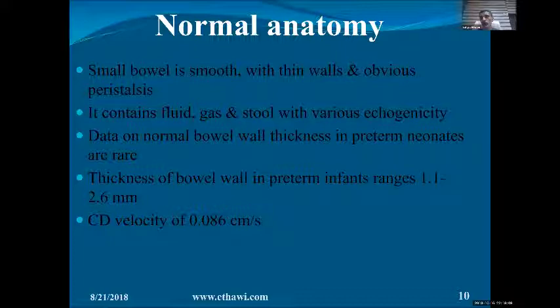So you measure all the time of the beams of the ultrasound going and coming back to you. While in pulse Doppler, you will concentrate on either A or B or C or D, and you ignore the rest. You should have a gate concentrated on D to look at D and ignore the rest.